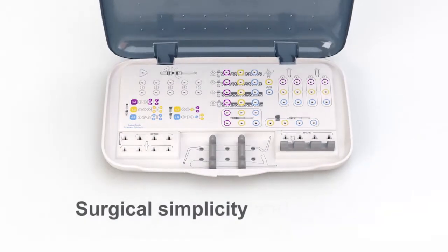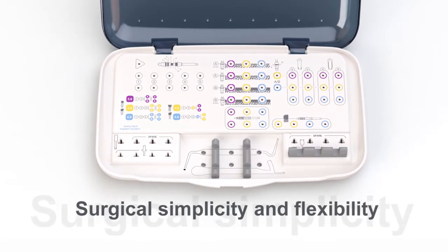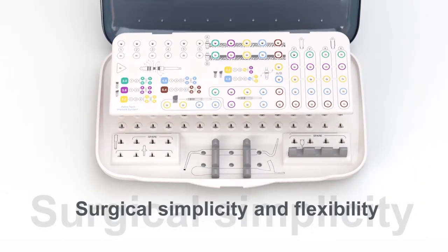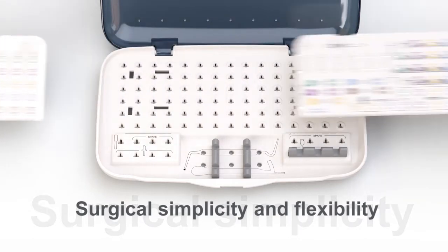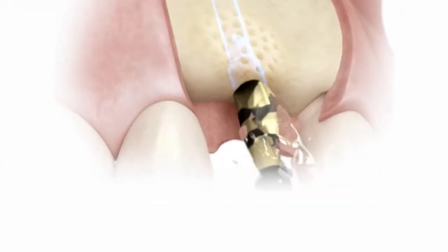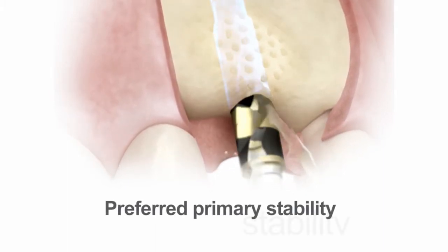The versatile implant designs are supported by just one surgical tray with an intuitive layout for effective handling throughout the surgical procedure. Three interchangeable overlays allow for adaptation according to your clinical preferences. The flexible drilling protocols allow for preferred primary stability.